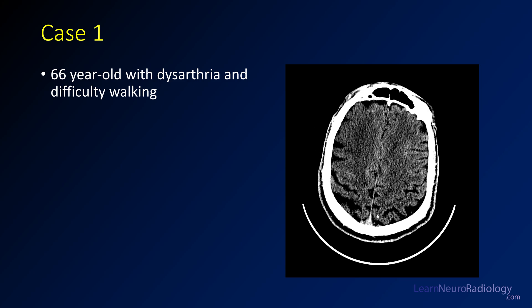Looking at the gray-white differentiation, I see gray matter kind of coating the white matter, except for maybe over here in the right frontal lobe — I see a little bit of diffuse hypodensity, maybe a little bit of loss of gray-white differentiation there.